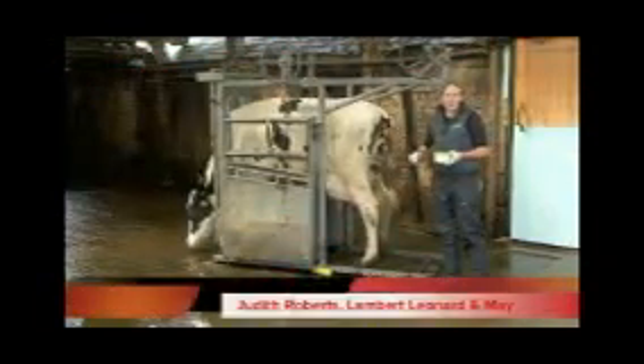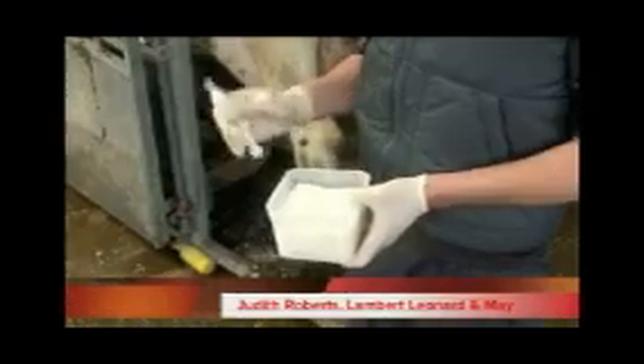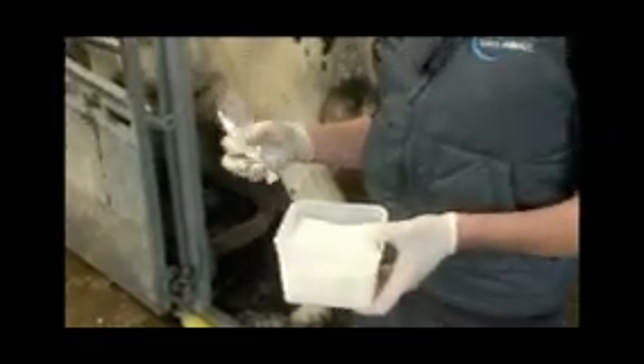We're now going to administer a dry cow therapy to this cow. We've got our dry cow therapy ready to insert, along with some swabs to clean off the teats to make sure we're inserting it as cleanly as possible. We need to be hygienic when we're doing this.